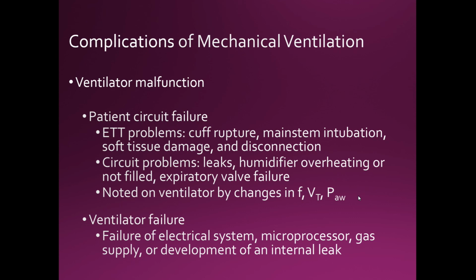And that's the beauty of the alarms. That's why we want the alarms, because in any type of failure, the alarms will kick in and ring. Now, it does its job. We have to do our job and answer the vent alarms. Ventilator failure, basically if it's electrical, if it's something wrong with the ventilator again, go ahead and switch it out. And that is it, my RT230s.